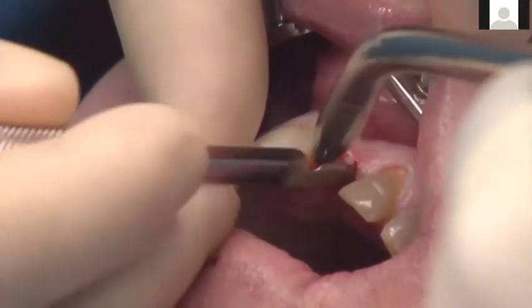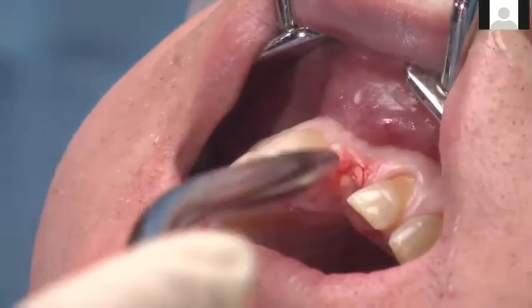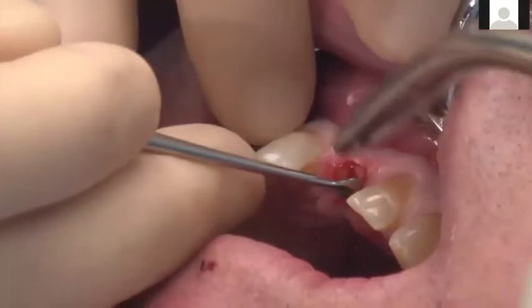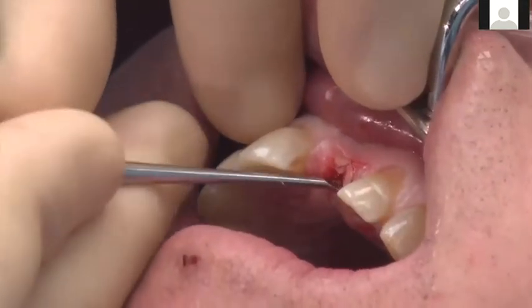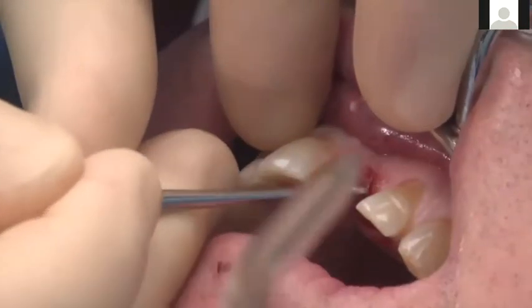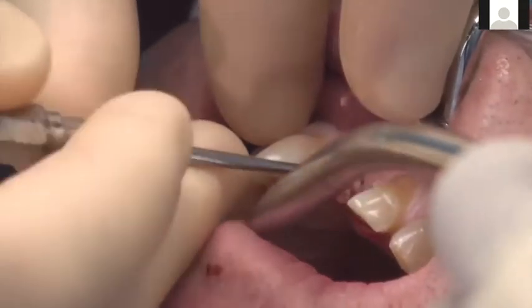So once you have done this and made the outline, then we usually take a Molt curette. You can take a Lucas curette as well, but I usually prefer a Molt. With the Molt curette, I go in and do almost like a periosteal elevation to try to get that off of the bone as clean as possible. My goal is not to have any tissue tags hanging in there, but that's why I edited this, so that you can see more of it.